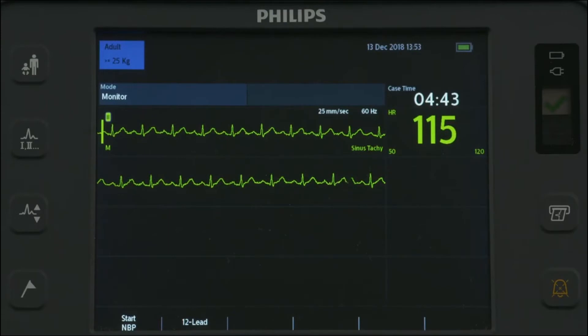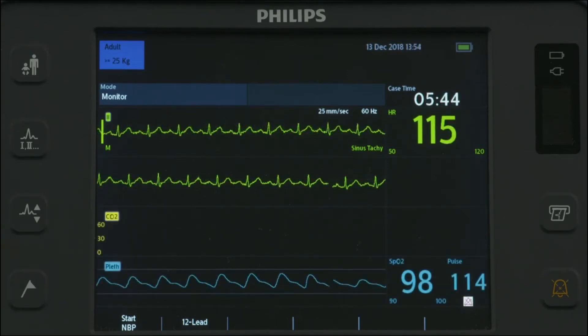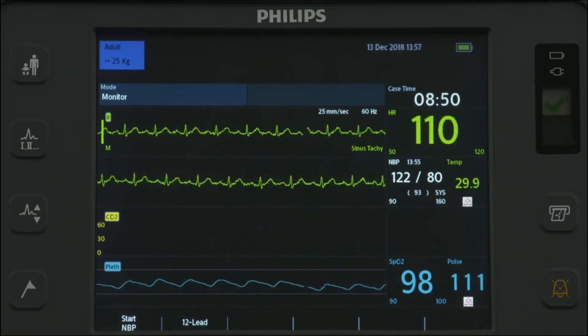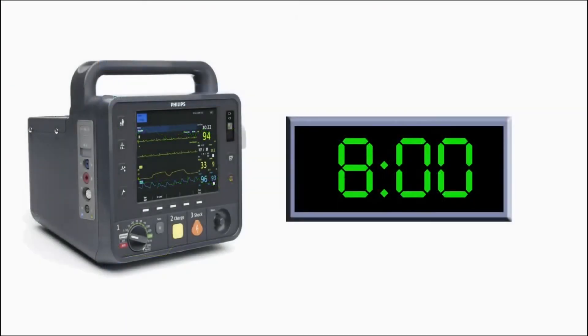In Monitor Mode, you can monitor one ECG waveform acquired through a 3-lead ECG cable set, or up to four ECG waveforms through a 5-lead or 10-lead ECG cable set. Optional monitoring of pulse oximetry, non-invasive blood pressure, temperature, and/or end-tidal carbon dioxide is also available. The HeartStart Intrepid stores up to 8 hours of monitored trending data that can be displayed in time intervals on the screen.